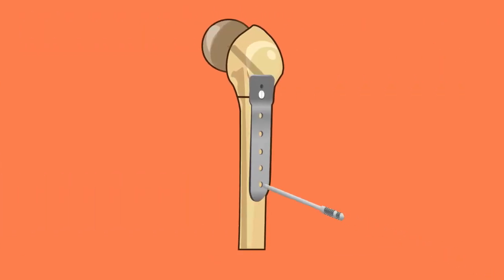Starting with the most distal locking sleeve, drill through both cortices and note the required screw length using the drill markings or screw depth gauge. Attach the AO handle to the appropriate screwdriver to screw in the first locking screw until fully threaded into the plate. Repeat the drill and screw process until all locking screws are inserted.